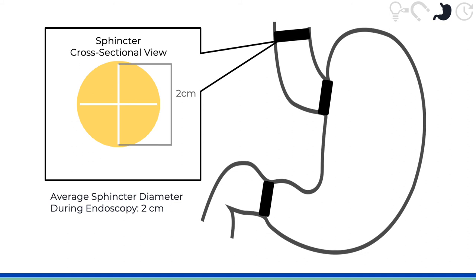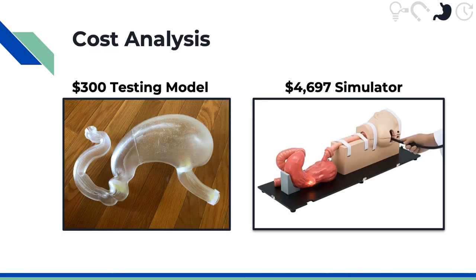You can also see a cross section of the sphincter, which has that sponge with a cross design. The crosses measure 2 centimeters across to more closely mimic what a sphincter is like when it's open. Based on our current model using resin, we anticipate that our testing platform will cost about $300. However, for mass production purposes, we anticipate using this to make a silicone mold, which can be more easily mass produced and softer, so it should function better. This is still very cheap compared to the over $4,000 simulators currently on the market.